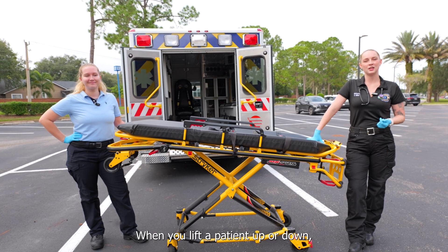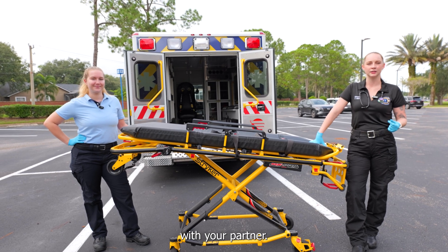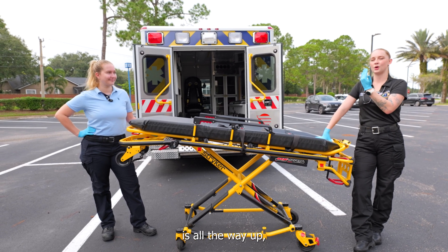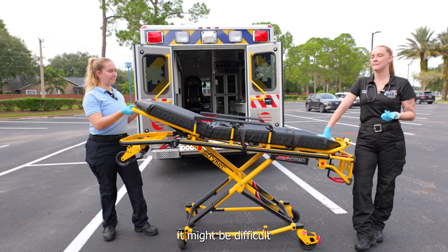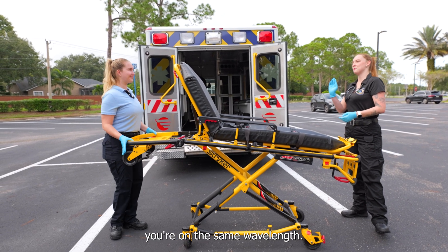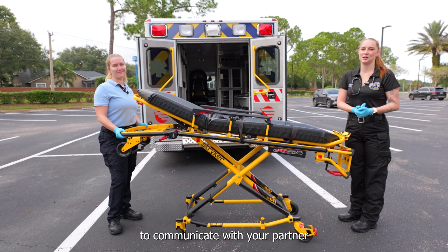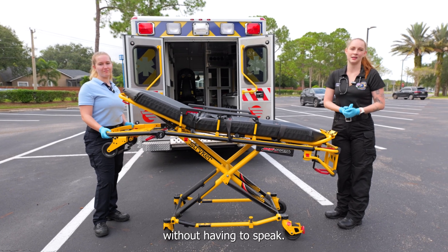When you lift a patient up or down, you need to make sure you're having clear communication with your partner. Sometimes when our patient's head is all the way up or they're sitting up, it might be difficult to speak with your partner, so just make sure you're on the same wavelength. At some point you will have kind of a way to communicate with your partner without having to speak.